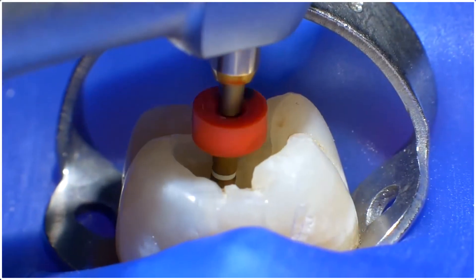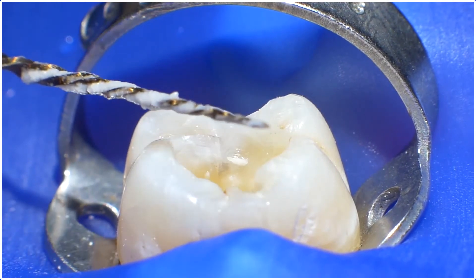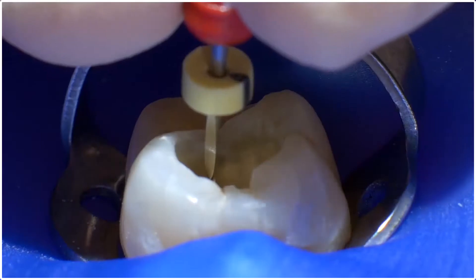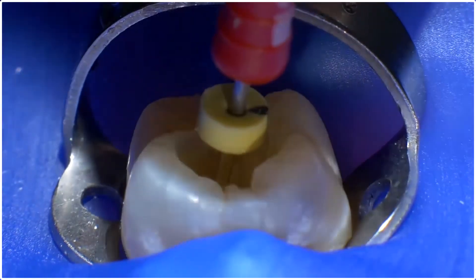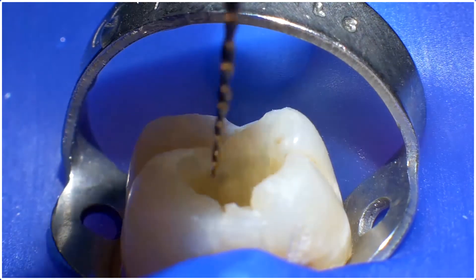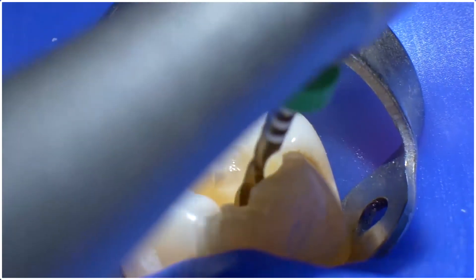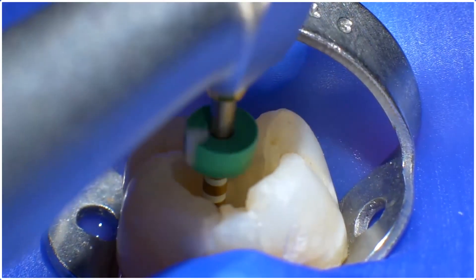Let's talk about the first scenario. If after the WaveOne Gold Primary has reached length, an apical gauging shows a size larger than 25, then move to the Medium WaveOne Gold — the green one. This is a 35-06 taper. It is used in the same manner as the primary, and since the canal has already been shaped to length with the primary, it takes no more than one or two strokes to get to the apex.